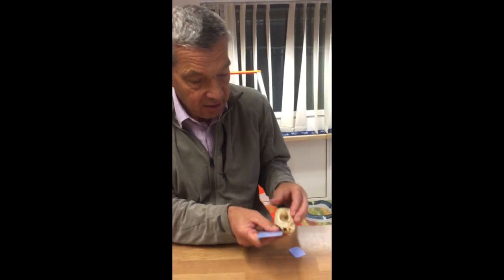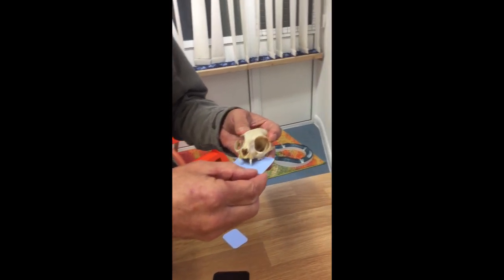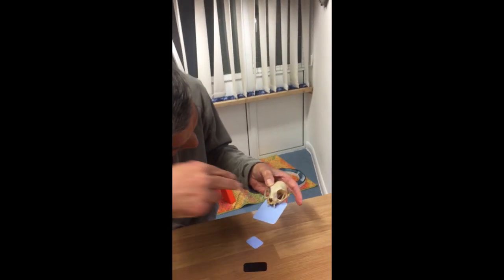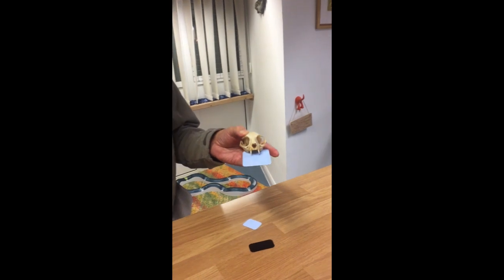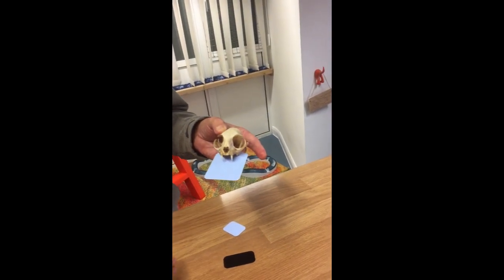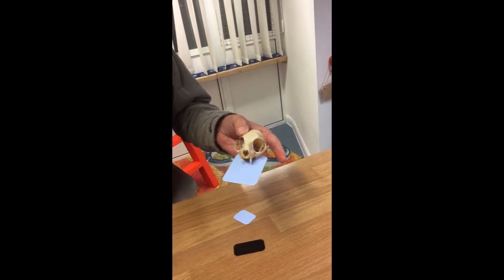Another thing which I find really important, I see that people fail on every time, they're so busy looking at these angles, they don't actually look at the cat's face when you're taking the plates. So if we've got that in there and we're looking at the beam, you need to get down and look at the mouth and look at the beam and make sure it's all right. So you really need to get down to cat's face level to look and check your angles, and that way you will get this image in your head of actually what you're trying to achieve.